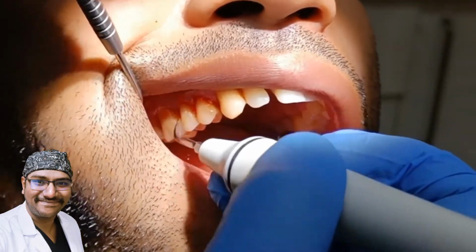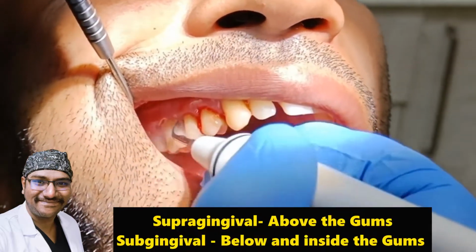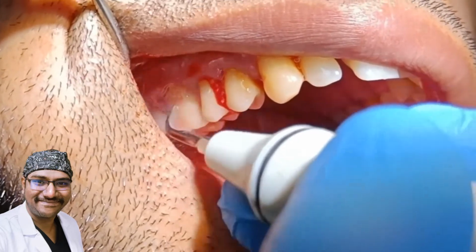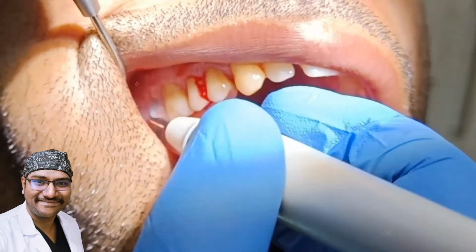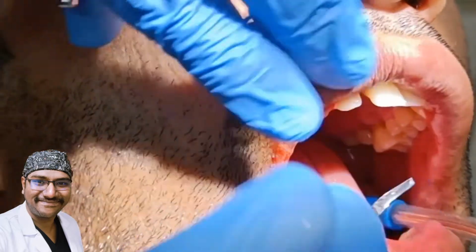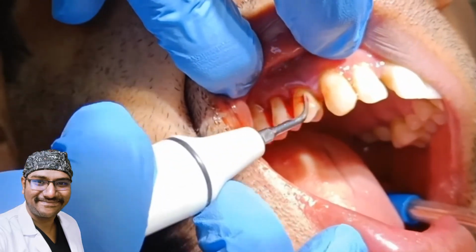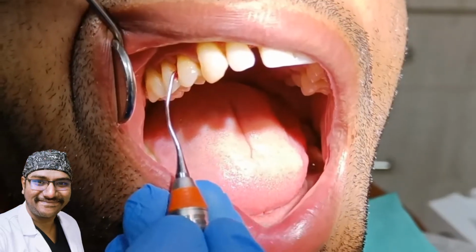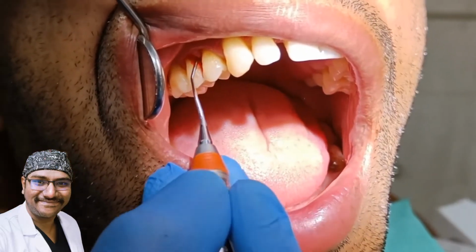Once we are done with that, we start off with supra and subgingival scaling. Supragingival scaling means that the scaler is run over the gums on the tooth surface, and subgingival scaling is when the scaling is done below the gum. A little bleeding, or sometimes profuse bleeding, is expected in periodontal patients, as the infected tissue is very edematous and the gums are also swollen. You are expected to get more bleed.